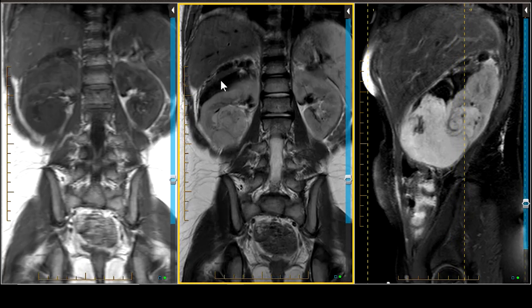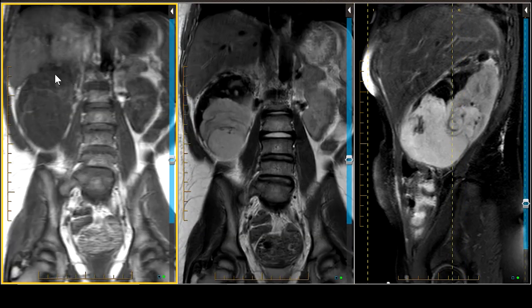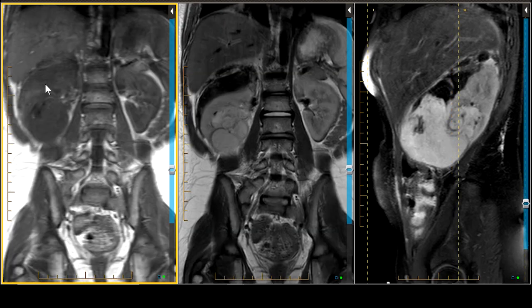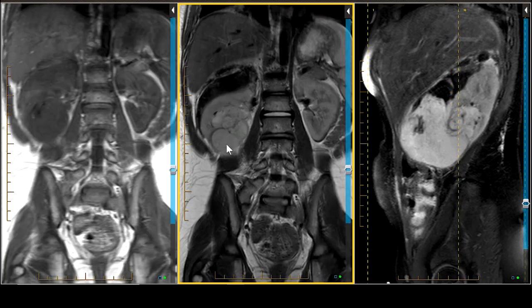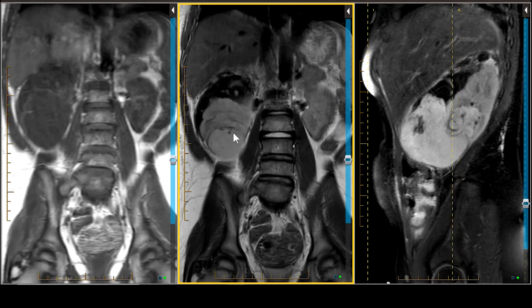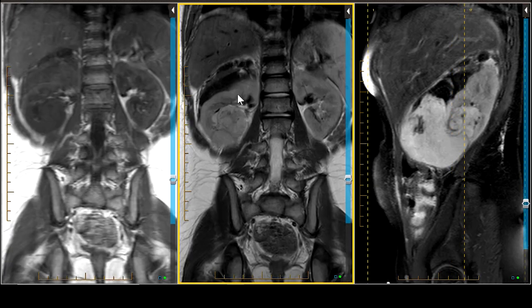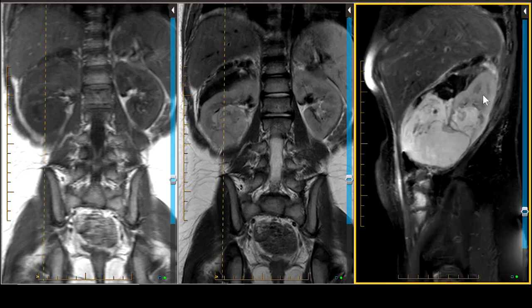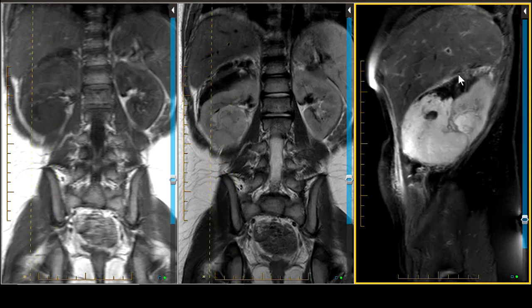There is a very low signal component on the T2 at the top, seen as more gray on the T1-weighted image. Inferiorly the mass has a more solid appearance — gray on T1, light gray or slightly hyperintense on T2. We also see what looks like more normal renal parenchyma. On the fat-suppressed image we see the renal parenchyma, portions of the solid mass, and this very low signal area that appears to surround the kidney, perhaps in the renal capsule.